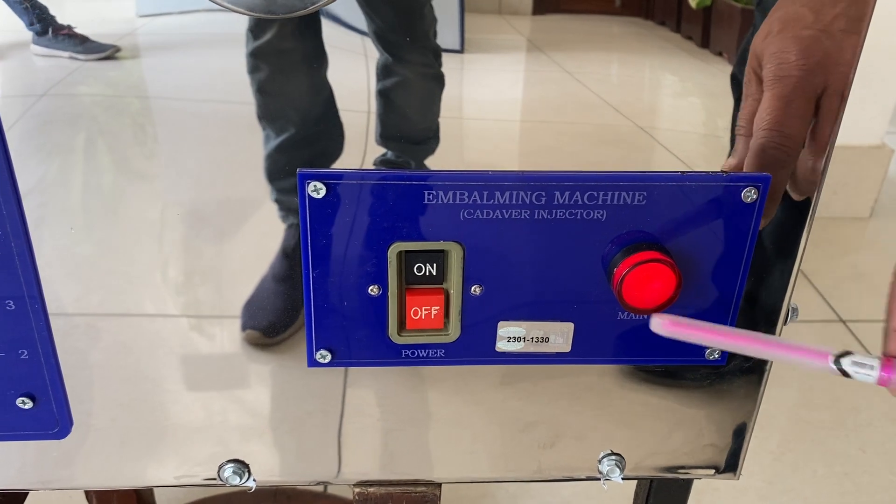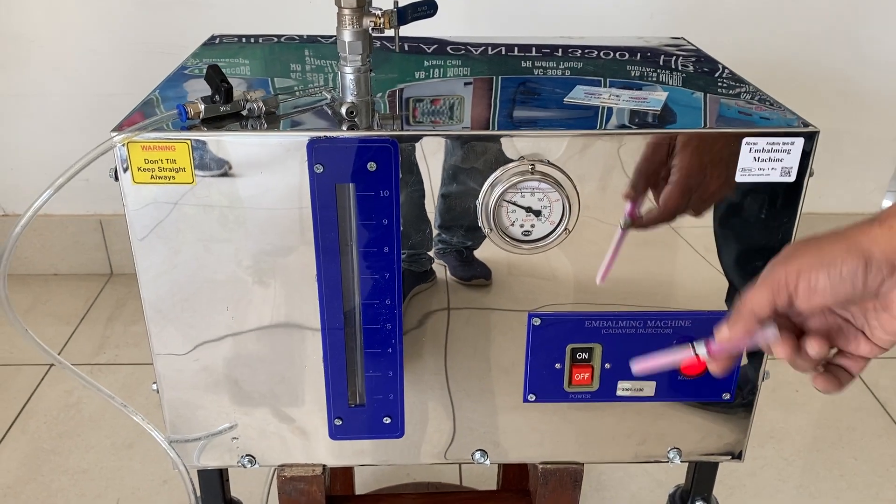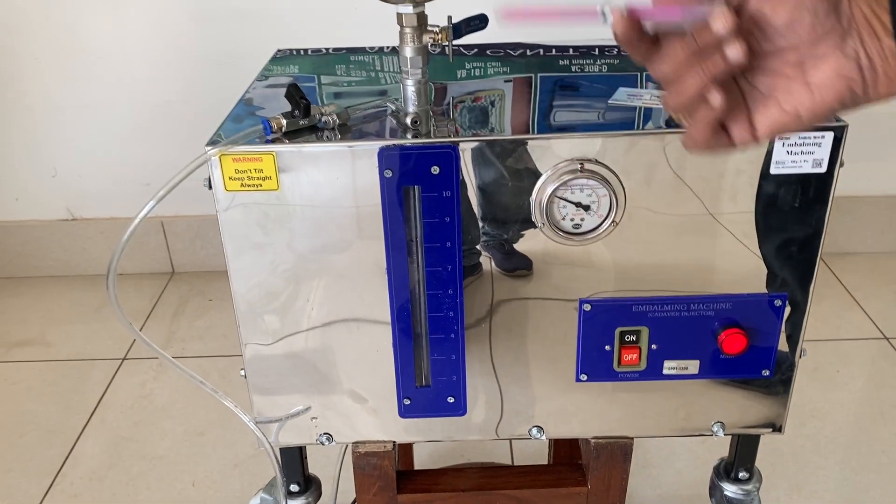This is a cadaver injector, or embalming machine — you can call it both. Then you switch it off when the pressure has reached 60. You can switch off, and then the pressure will still be inside and it will still work.